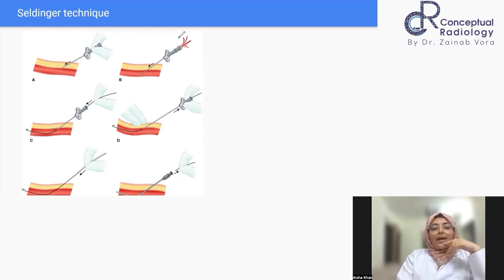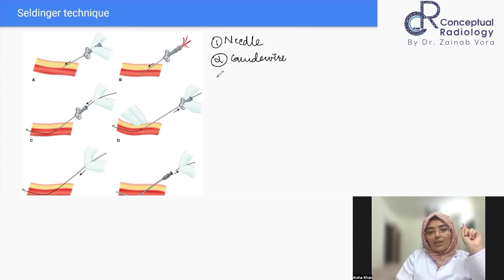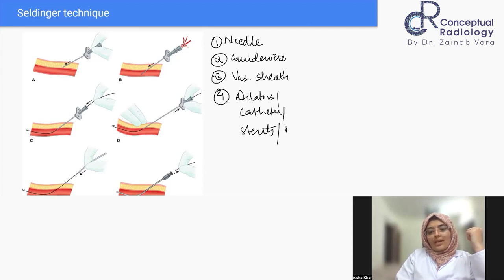सबसे पहले what you need to remember, इसमें क्या चीजें you have to put in a chronological order. सबसे पहले you need your puncture needle, उसके ऊपर you pass a guide wire, and after that you have to place your vascular sheath into place in the target artery or vein. And finally, once you have your vascular sheath, then there is no problem. You can use a lot of dilators, you can pass your specific catheters or your stents or your balloons over the vascular sheath, which is acting as a stable scaffold.